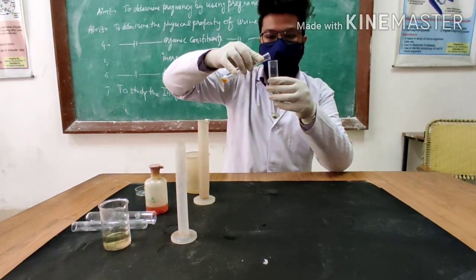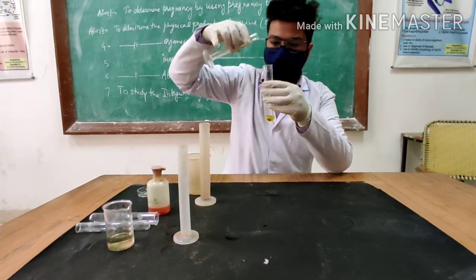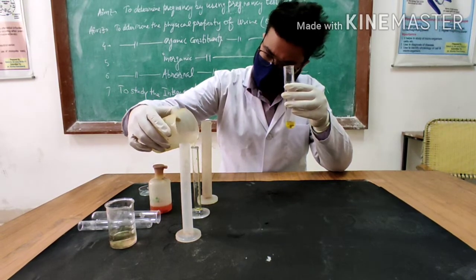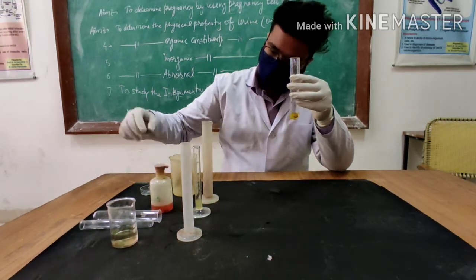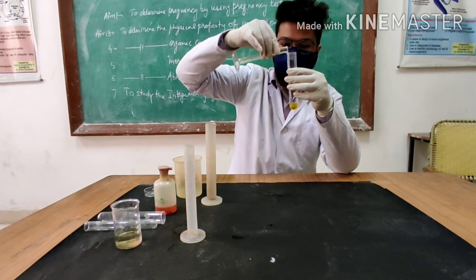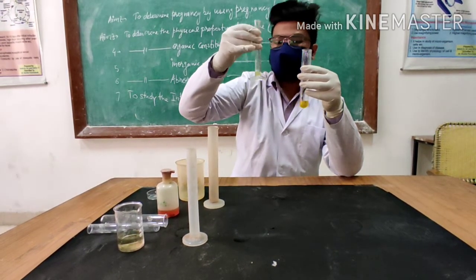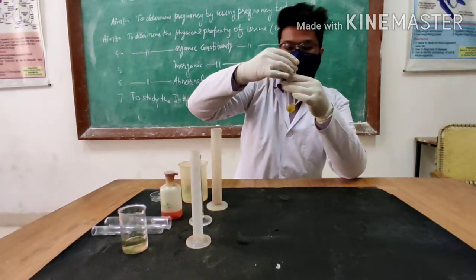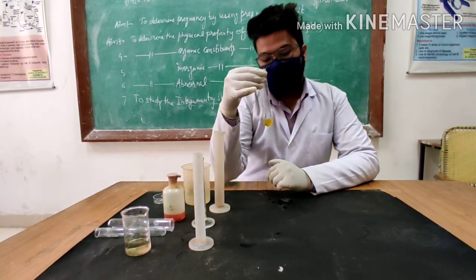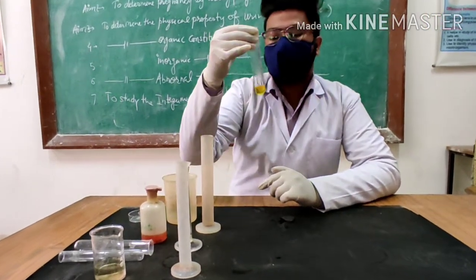Then we will add 1 ml of picric acid solution, followed by 1 ml of NaOH solution. After adding all 3 components, we will mix it thoroughly. The appearance of orange-yellow colour after performing this test confirms the presence of creatinine in the given urine sample.